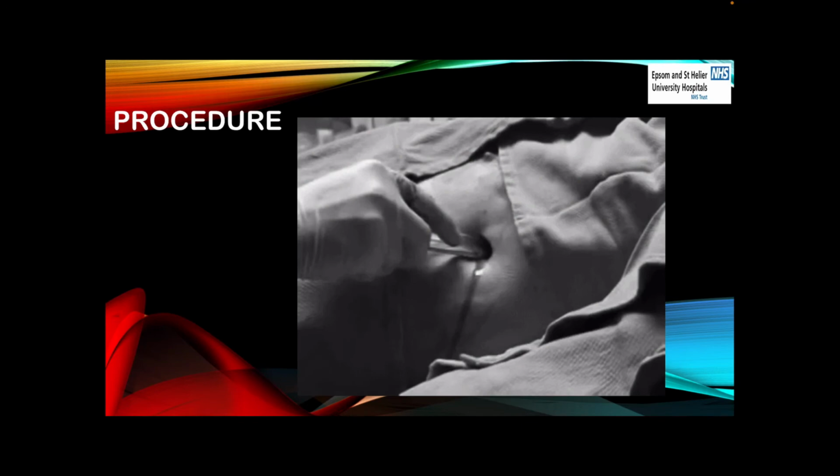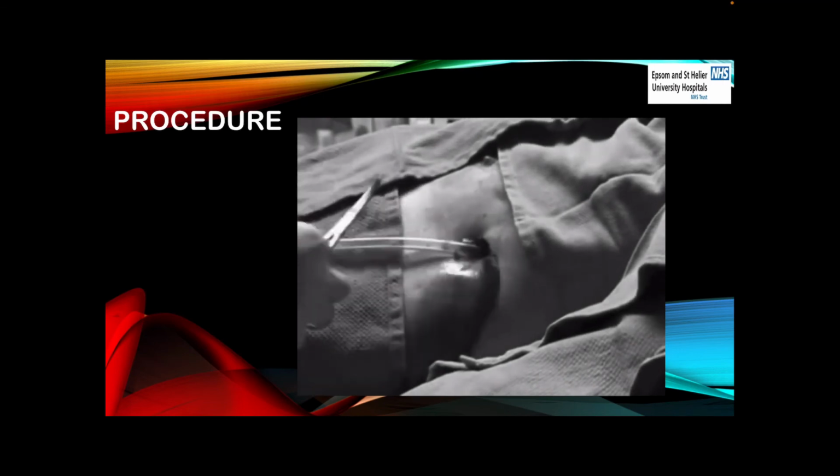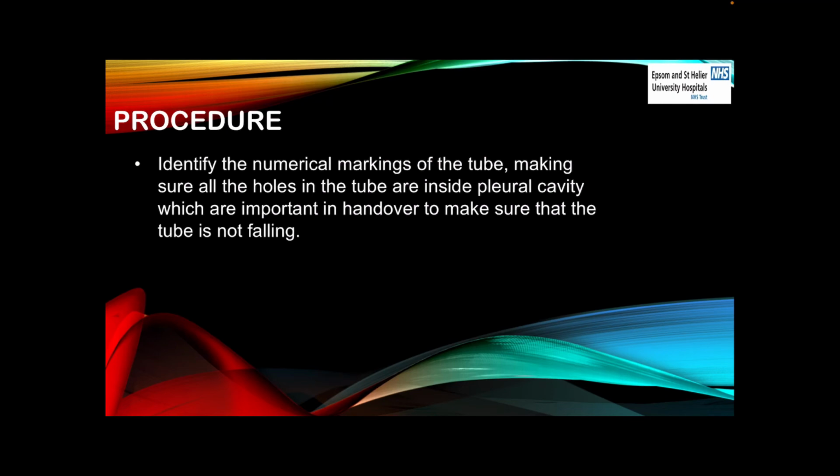So we can see here, after the insertion of the chest drain, this is how it goes, and push it. That's it. This is the way it goes, and then you push the chest drain. Okay. Identify the numerical markings of the tube, as we said before, making sure that the holes of the tube are all inside the pleural cavity, which is important in handover to make sure that the tube is not falling.